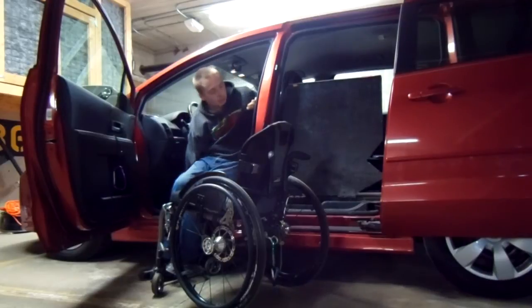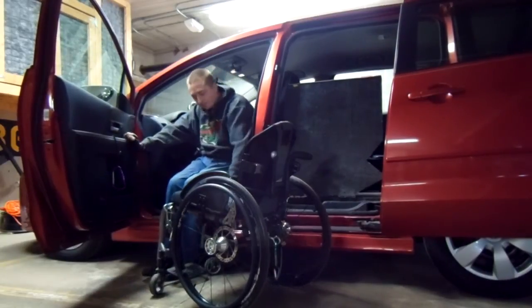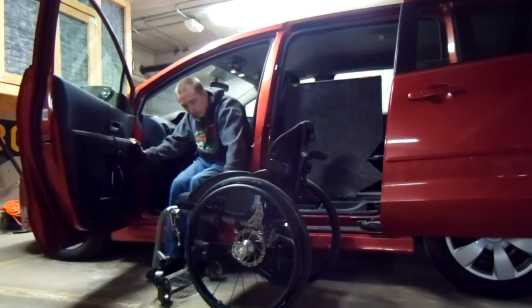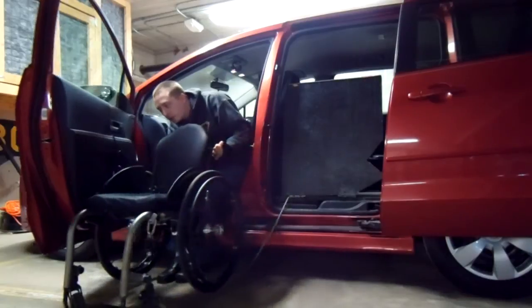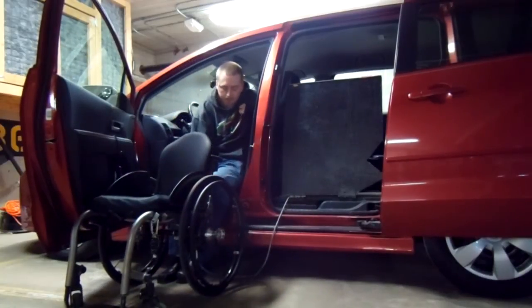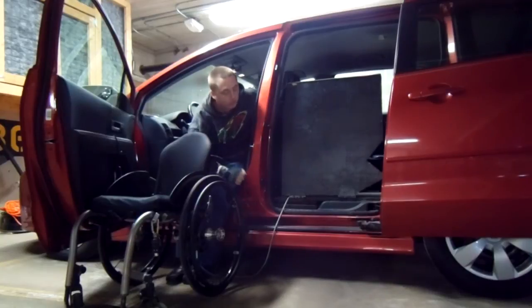I give the ramp and the chair coming back on the ramp a little more room. Pull out the brake. Get the chair out of the way of the ramp. It took some experimentation on how to get all the positioning right, but once I figured it out, it's very easy.